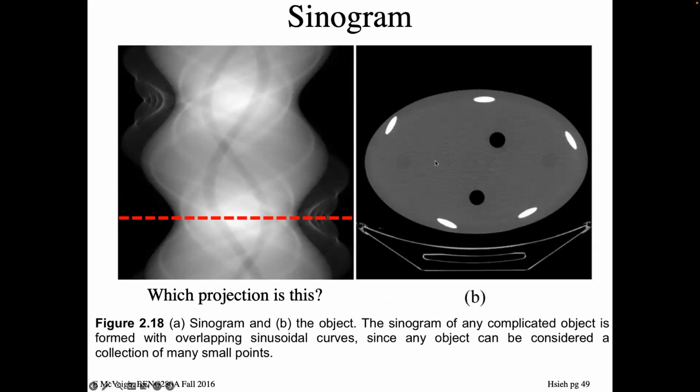As I go 90 degrees to that, the object narrows down to here, right? So this is a vertical projection. This is a vertical projection. Now you just have to decide which side. Is it on the right side going this way, or the left side going this way? That depends on how you want to define the positive direction of your detector.